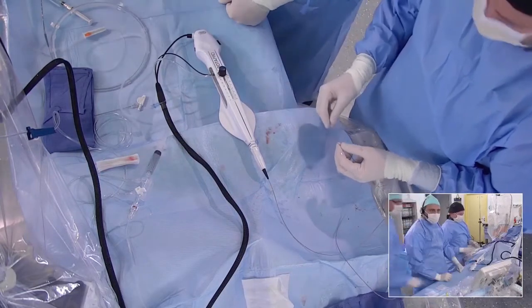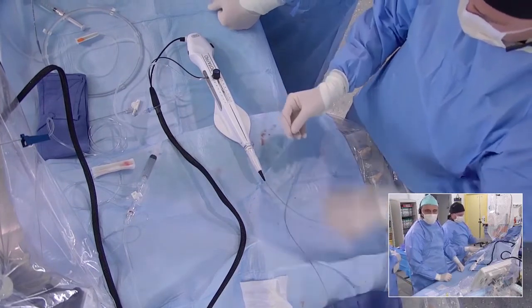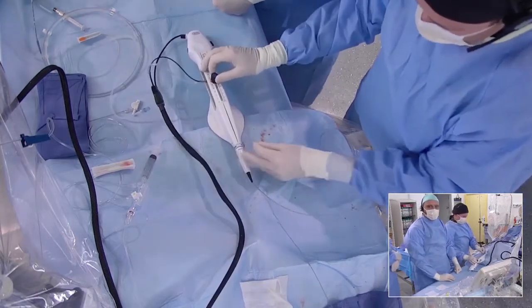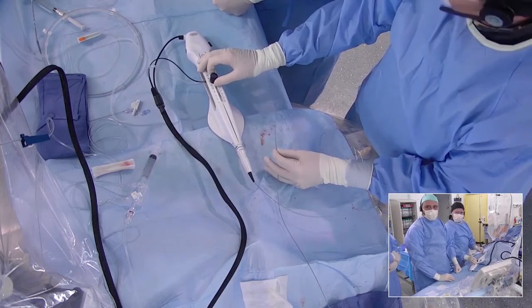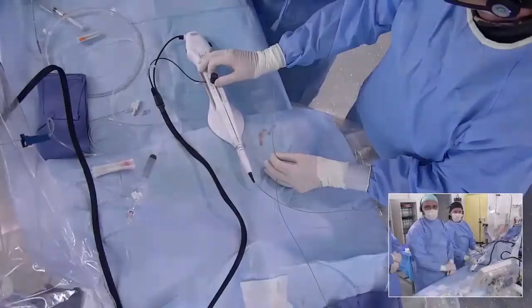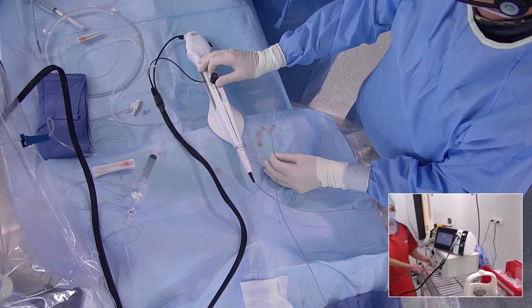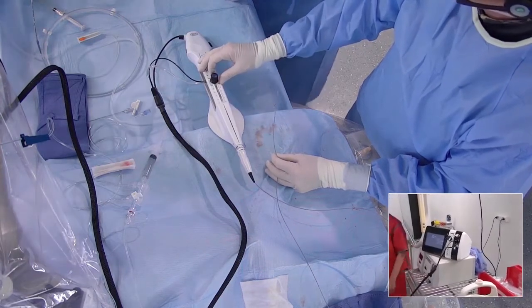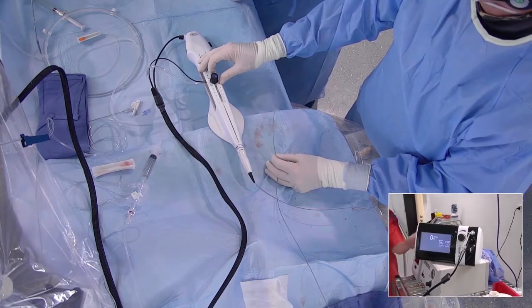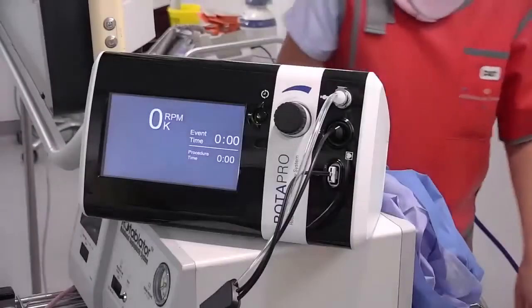And all the previous cables are now wrapped up in the single cable to the new console. So that's very neat. It might be worth to see now the system with the connection. By turning a bit the camera towards the console, yeah, towards that direction over there. There you go. So you see the system, the three cables, and the air cylinder that is just hidden behind, but everything is there. And the beautiful thing is that there is nothing on the ground. No pedal. Everything is on the table now.